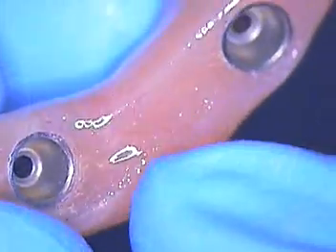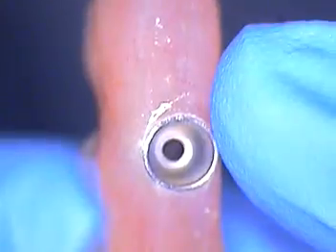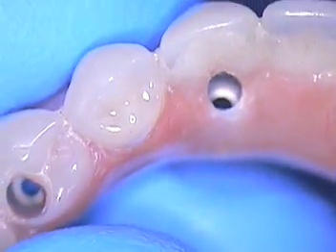So we'll check for that. We're also going to check the soft tissue area where it compresses the tissue. We had a very, very nice try-in last appointment, so all goes well today. Should be pretty straightforward.